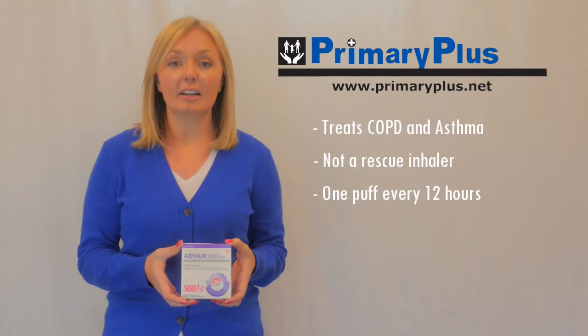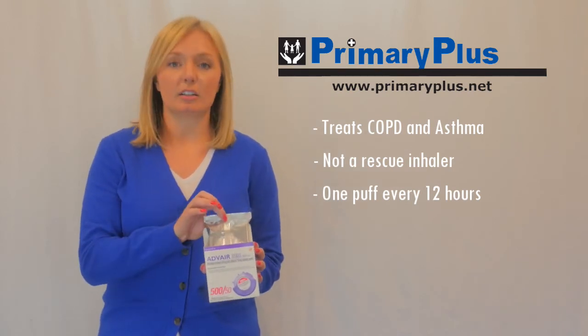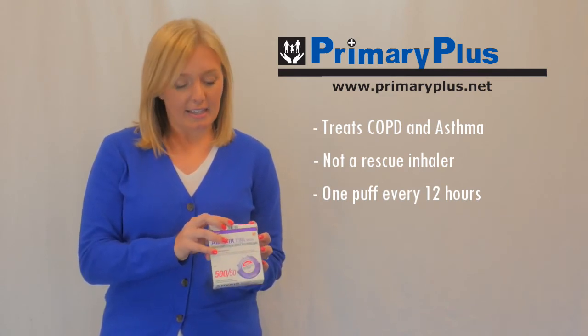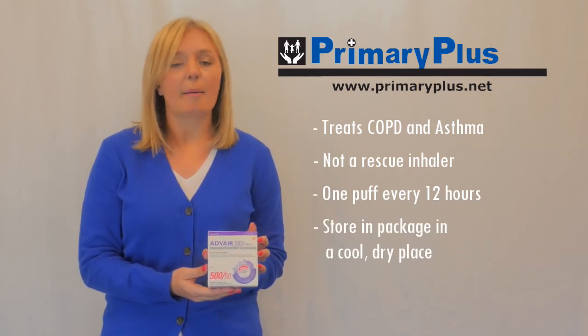When you get your inhaler home, it's going to come in a cardboard box, and inside the cardboard box it'll be sealed in a foil container. Until you're ready to use it, keep it in this box and in the foil container in a cool, dry place at about room temperature.